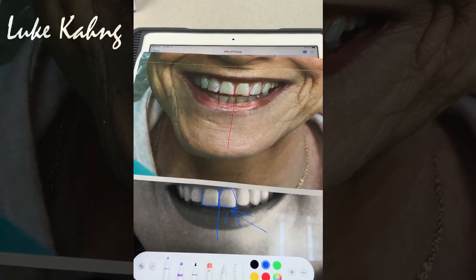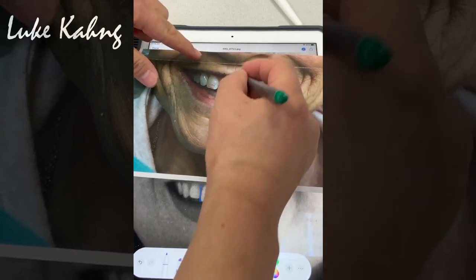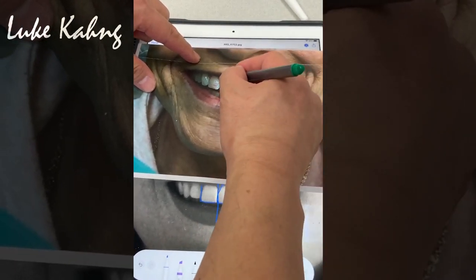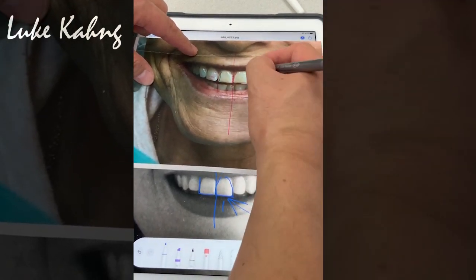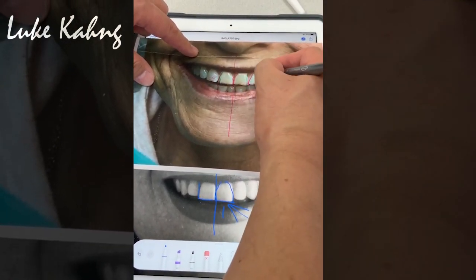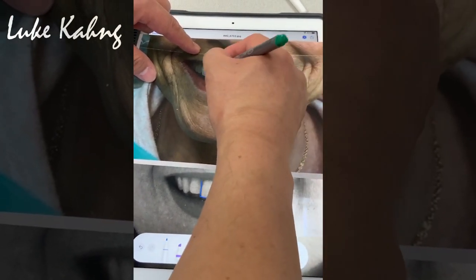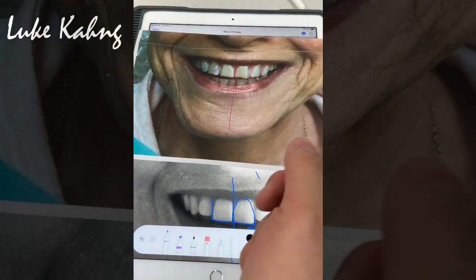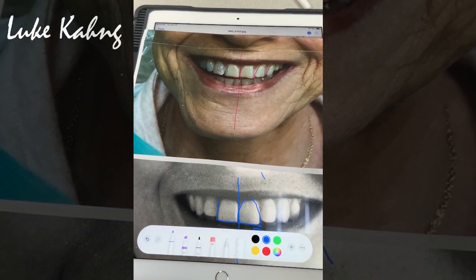So I'm going to move more shape here. Okay, so in order to make the square shape, just like the patient showed us, here's a cut, here's a cut. A little bit longer. Anyway, we can make the design. So the doctor has to prep really more here. Right. That being said.